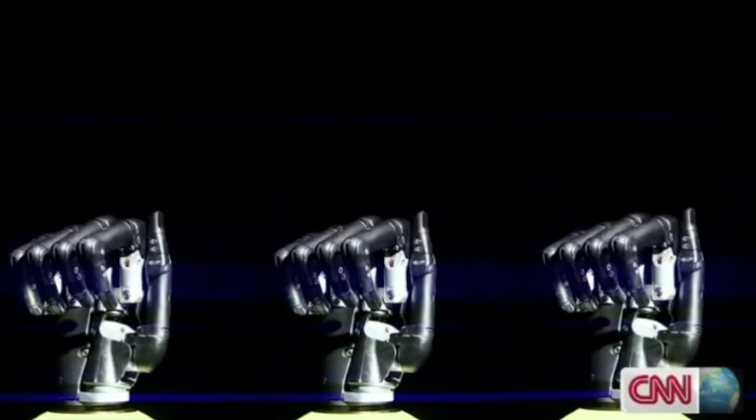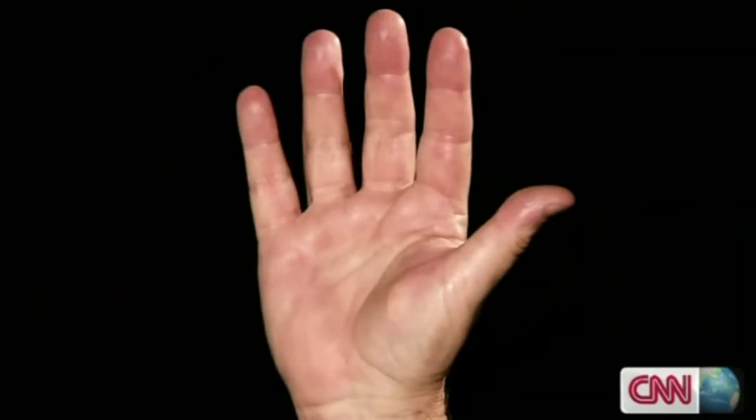We sometimes forget what vital and complex tools our hands are. It's been one of the great challenges of modern prosthetics to mimic them. In doing so, the next generation of bionic hands is transforming thousands and thousands of lives.